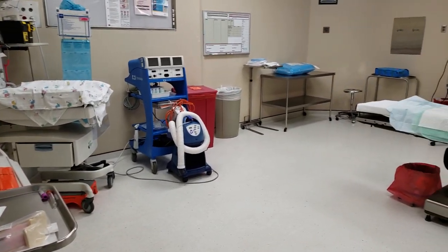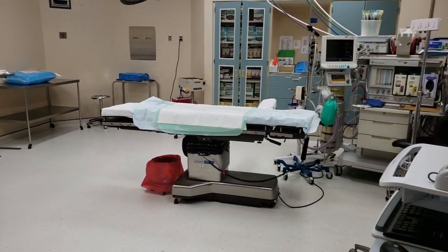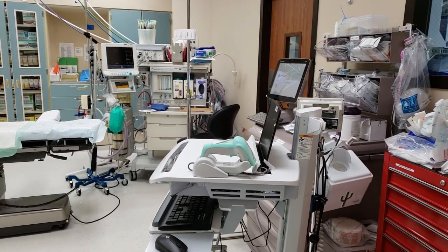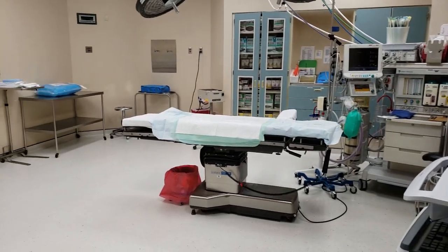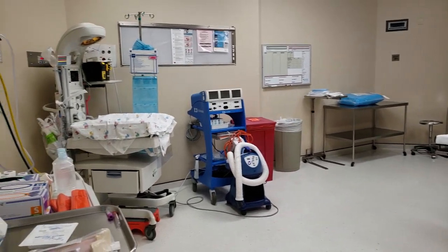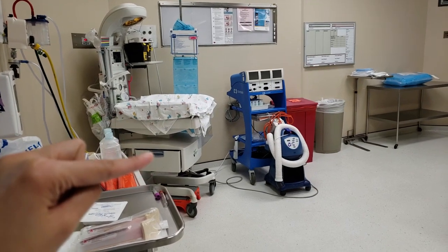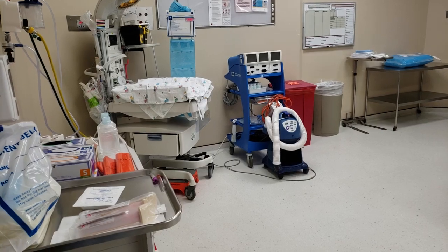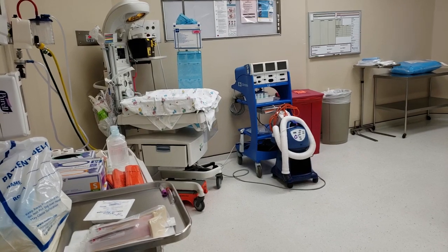Hey guys, I just wanted to show you what a typical operating room looks like. And this is what ours look like. It's going to be a little different than the operating room in the main OR because this is actually the OB floor. That's why you see this baby warmer thing. That's a machine that warms up the baby. There's a heater up here and you press a button and then it'll heat up. I don't really know much about the machine because that's not my thing, but that's basically where the baby goes.